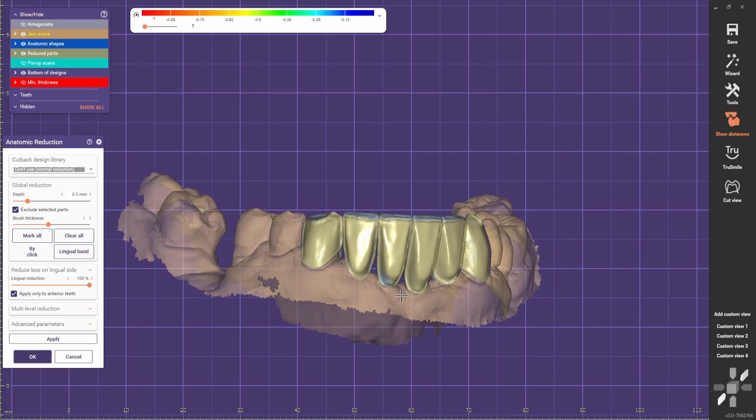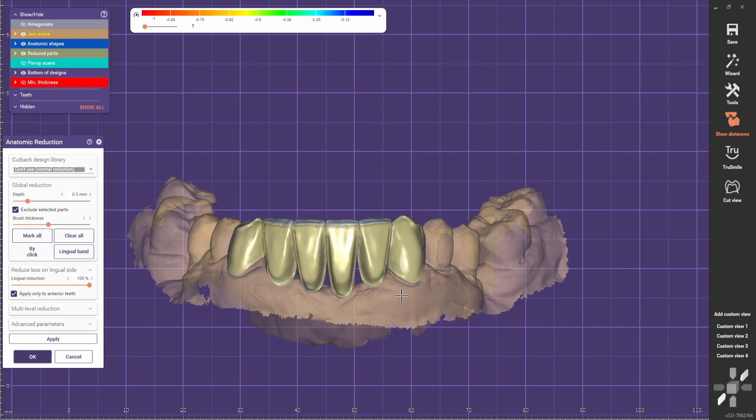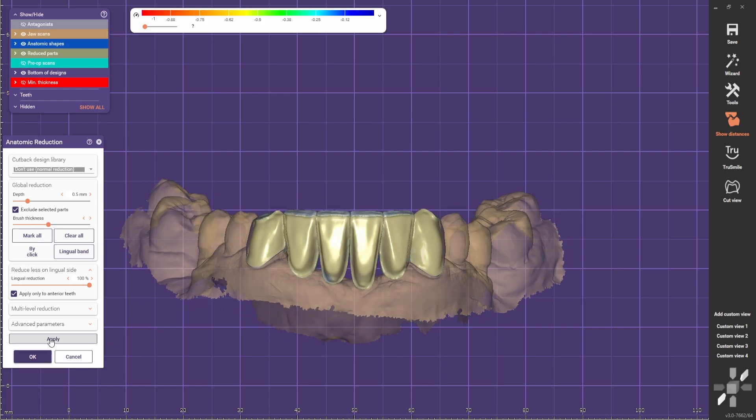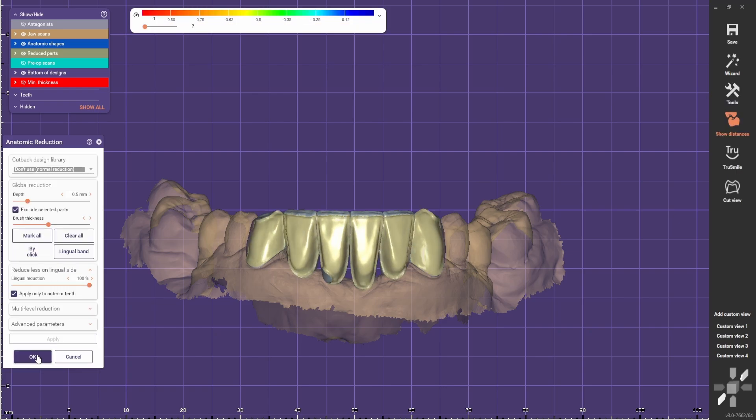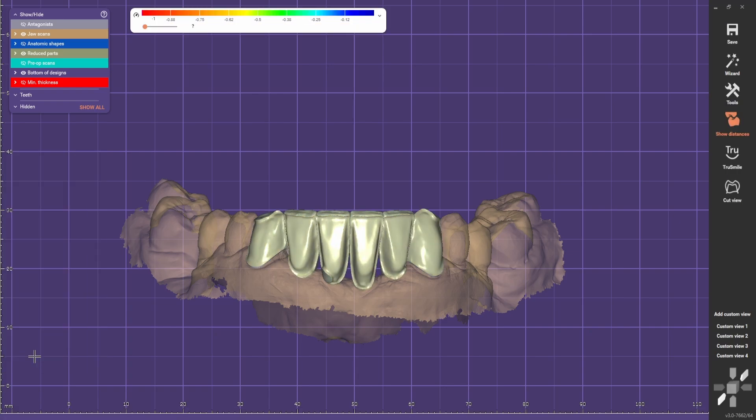Now if you are happy with the reduction, go next. You can go apply and OK.